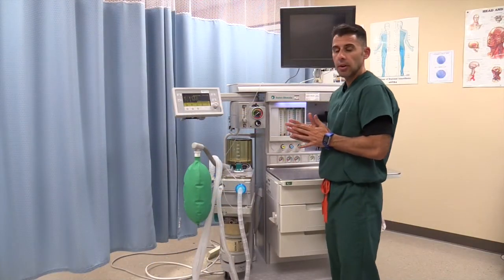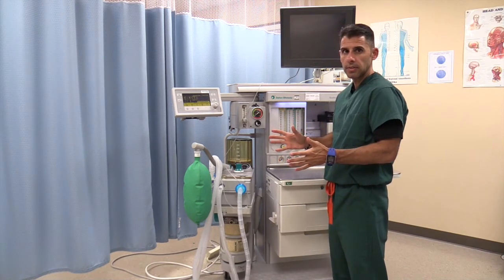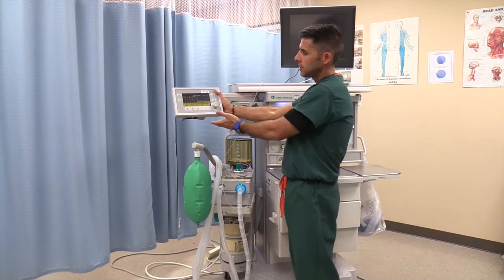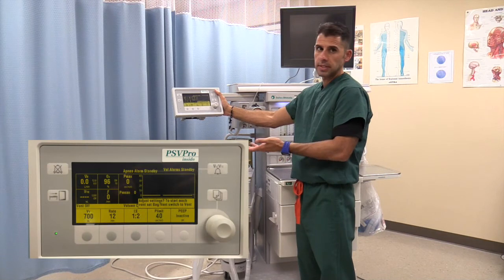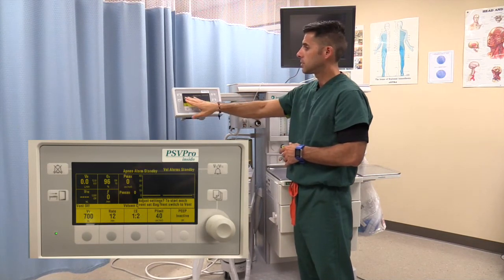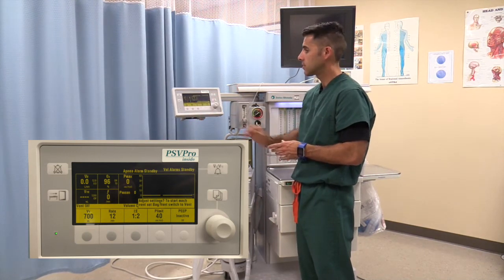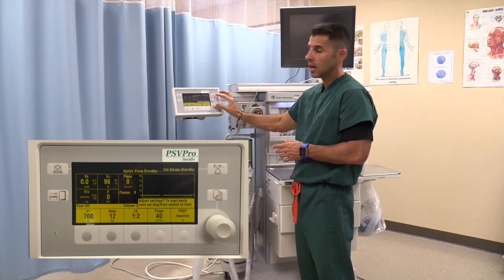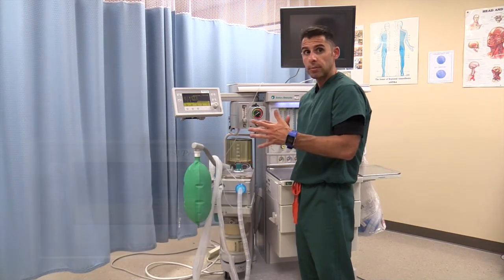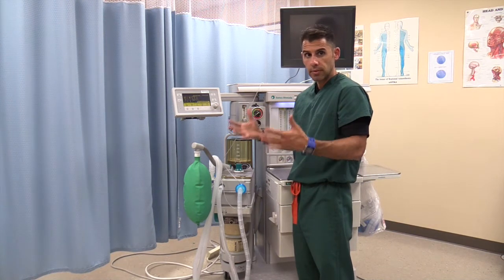Before we start with the arm of the anesthesia machine, we are going to identify all the different components. Number one, you are going to see a screen — this screen is the ventilator. All your ventilator settings are on this screen: tidal volume, how much oxygen you are delivering, peak airway pressure, and everything else. You change all your settings through a knob or by clicking the menus. Every ventilator in every machine is different, so become acquainted with whichever ventilator you are using.